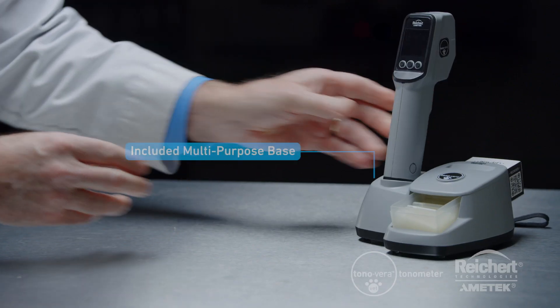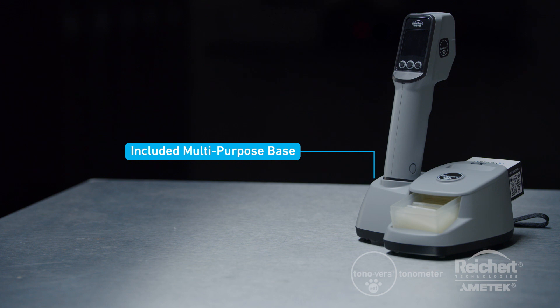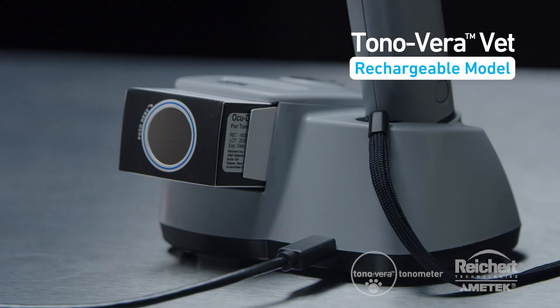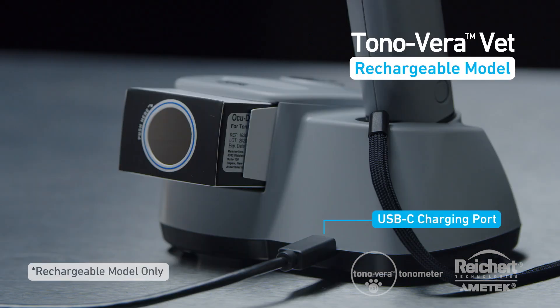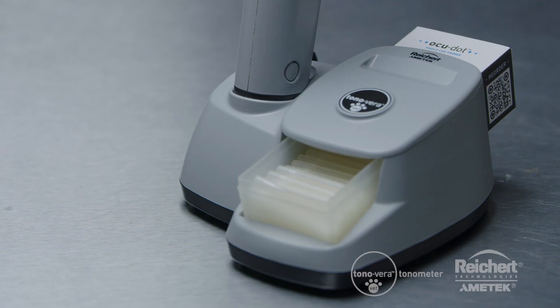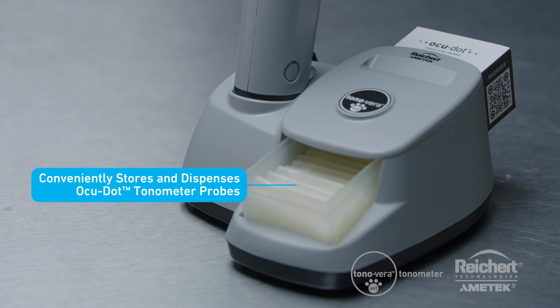The multi-purpose Tanavera Vet base comes standard, and it serves as a convenient location to secure your Tanavera Vet when not in use. For the rechargeable model, the base charges the device so it is always ready to use. The base also conveniently stores and dispenses the AccuDot tonometer probes.